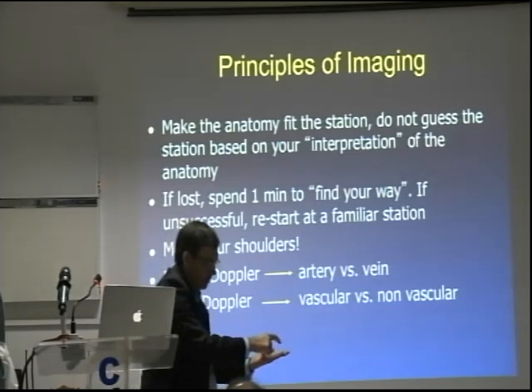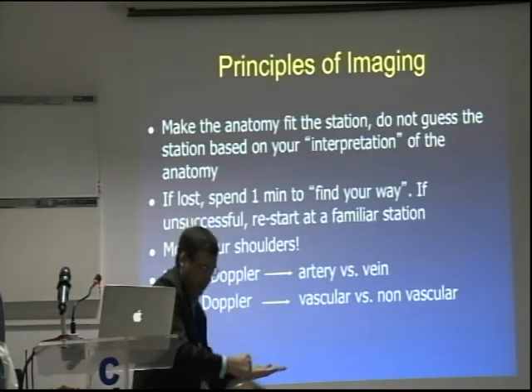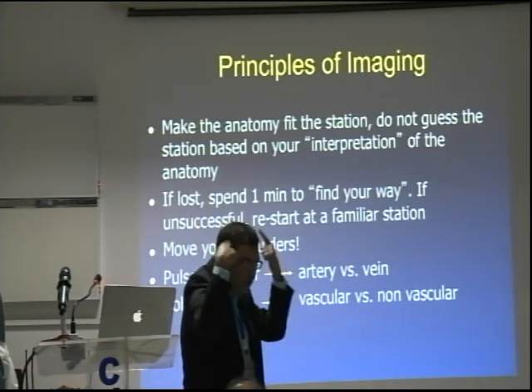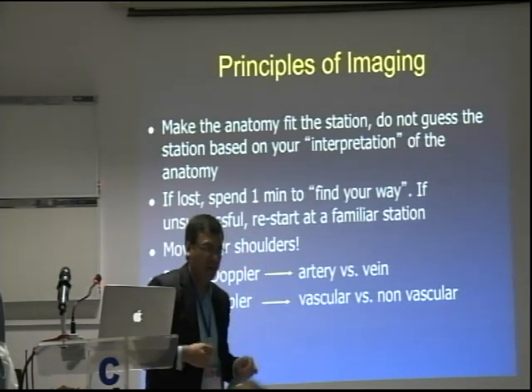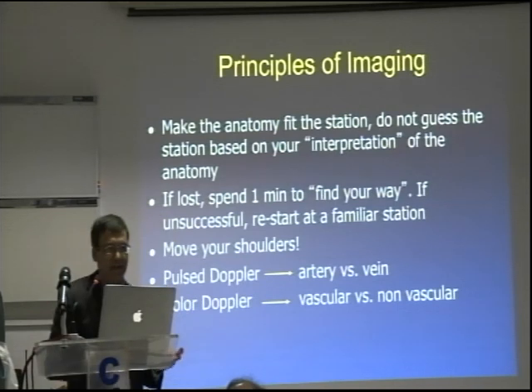The wheels are going to be at 90 degrees from that, and the transducer itself is going to be on the completely opposite side. So just to get an idea, if I'm holding a scope in here and the scope is in the patient, you can get an idea which way the transducer is. That gives you some idea about which way you are looking inside the body. Okay.